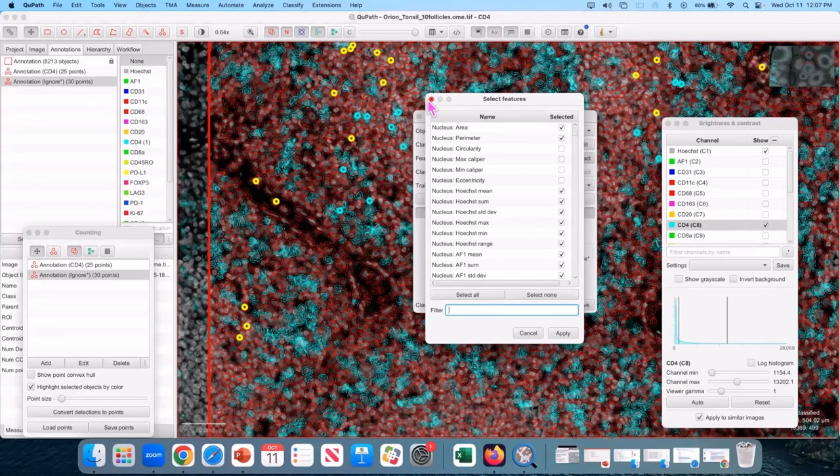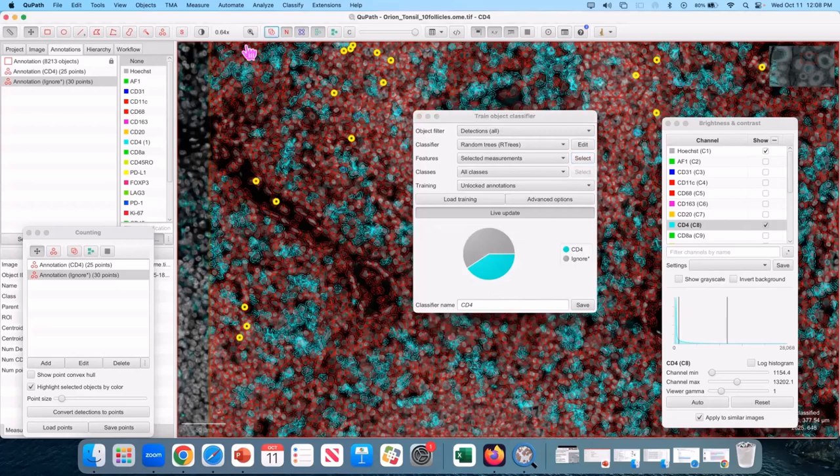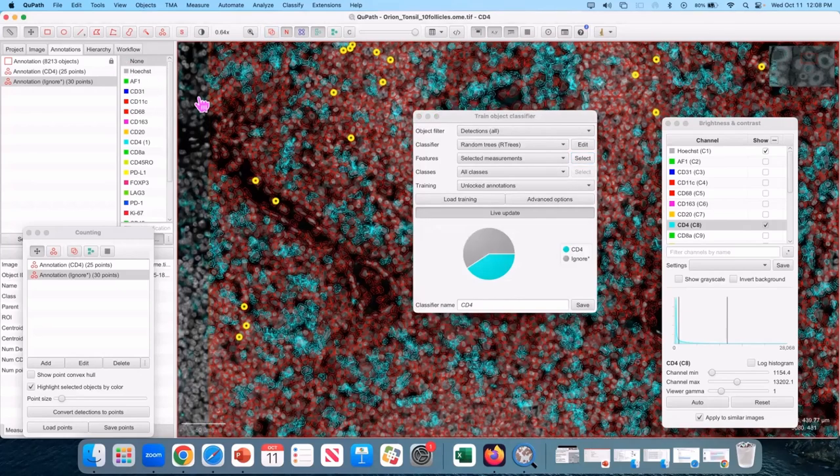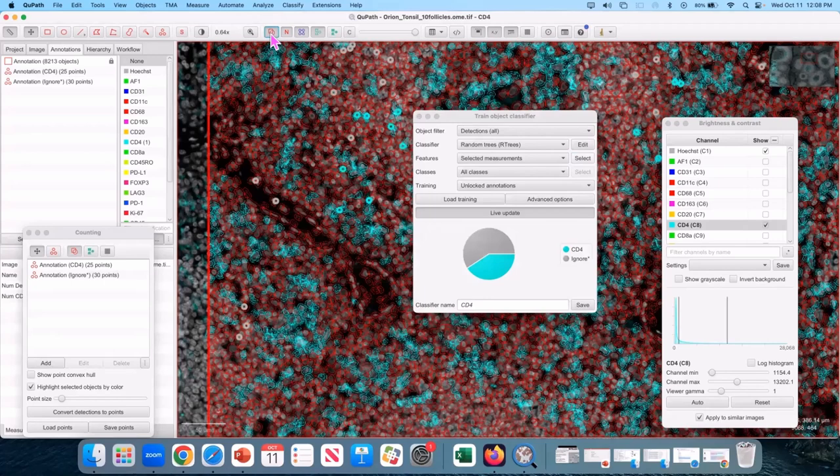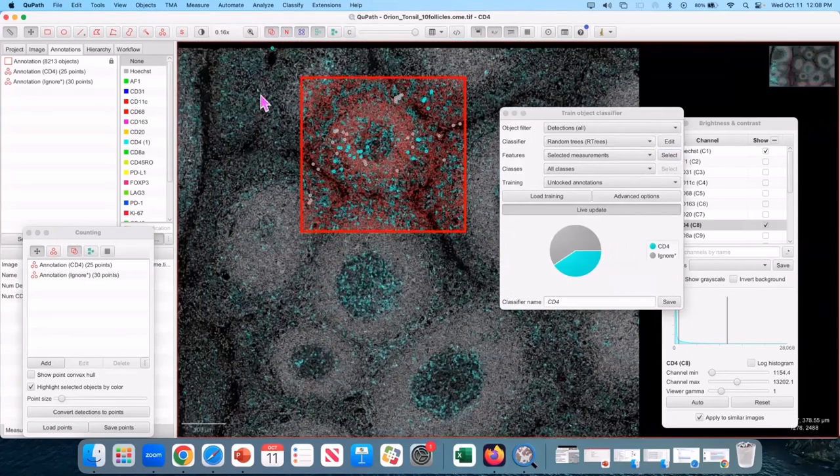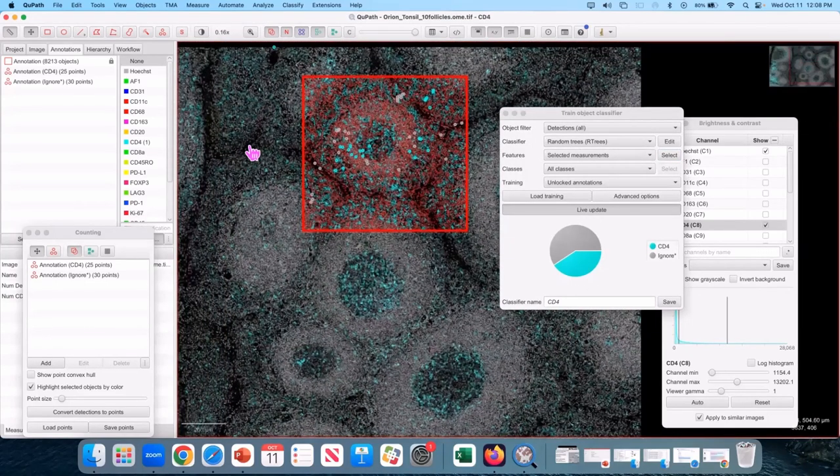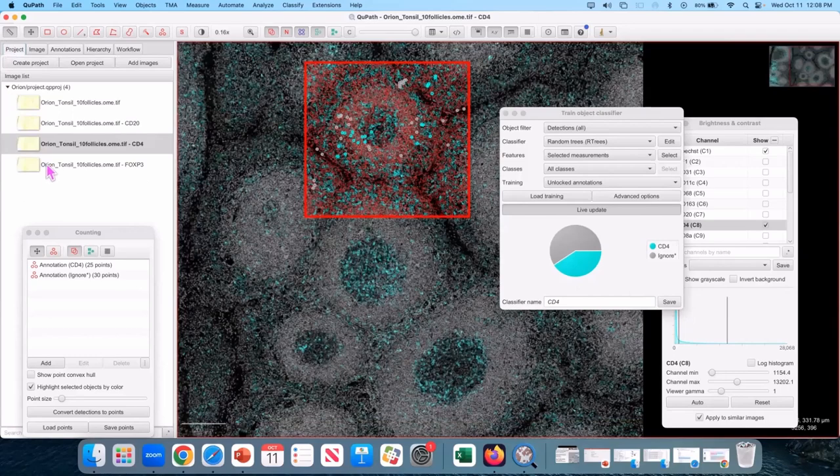If you turn off annotations and deselect them, they go away. But if they're selected, they'll still show, so you have to deselect. Who has a reasonable CD4 classifier? Save it. Move on to FOXP3.